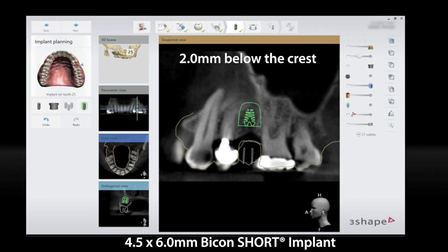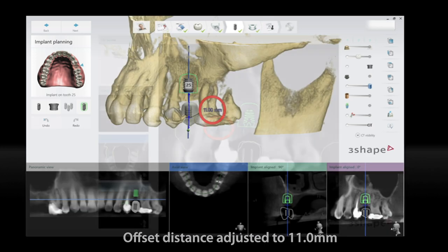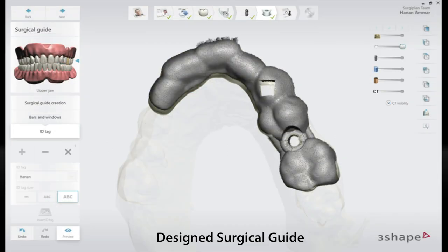This is the final virtual placement of the Bicon implant. Again, it is 2 millimeters below the alveolar crest, and the offset distance is adjusted to be 11 millimeters, so we need a pilot drill with a stopper at 17 millimeters. The designed surgical guide is then exported into STL.